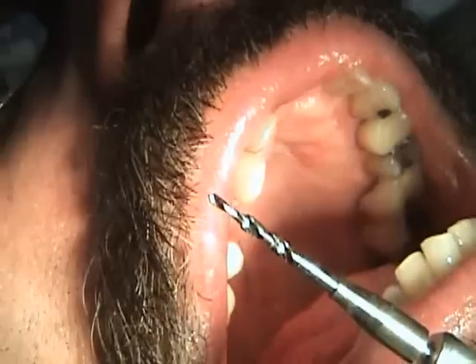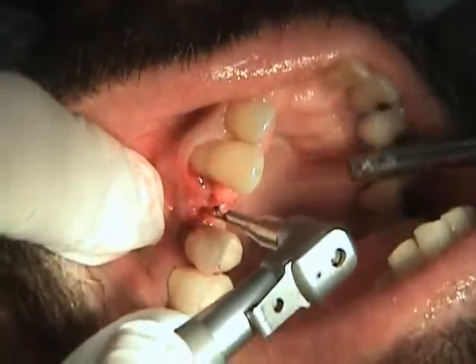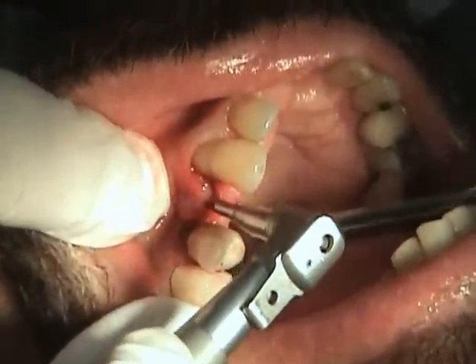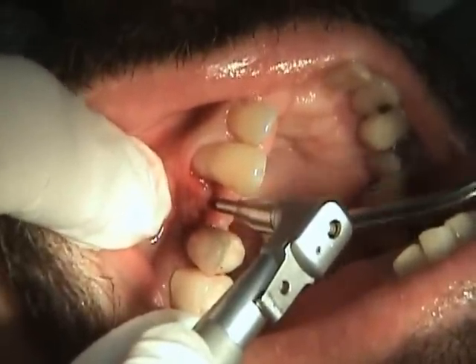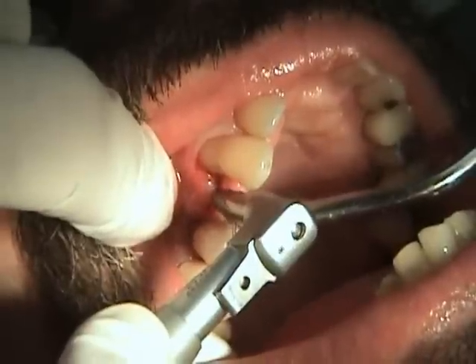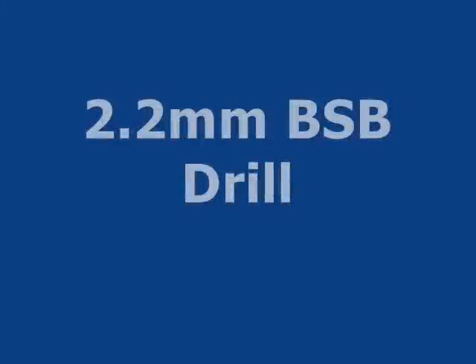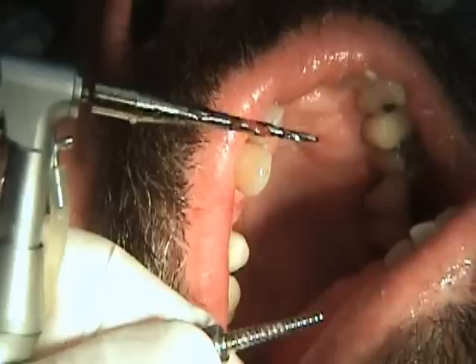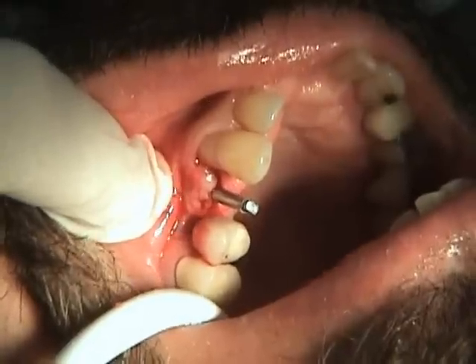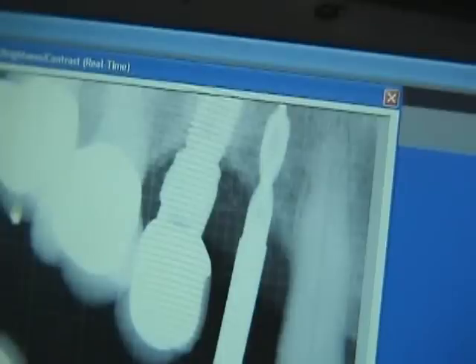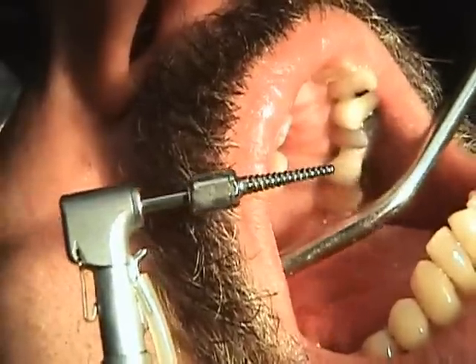We're introducing the chisel just enough to widen the bone by about a millimeter or two. Once widened, we're going to use the Blue Sky Bio starter drill, which has a step of about 1.5 millimeters on the first tip, widening out to about 2 to 2.2 millimeters. After it's introduced into the widened bone, we'll use a 2.2 Blue Sky Bio drill to get our initial osteotomy, then take an extra short parallel. Now we have enough width to begin introducing our wedges.